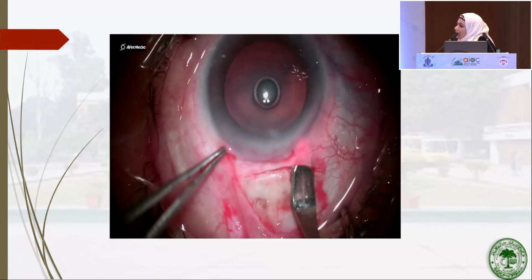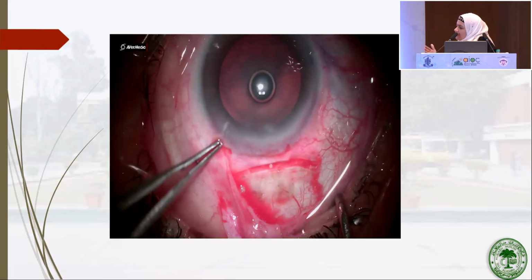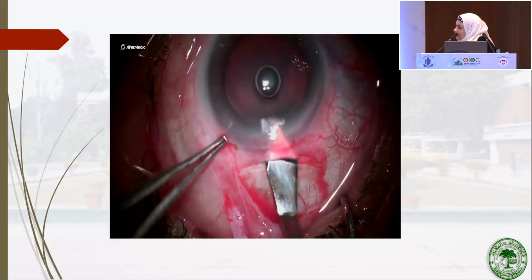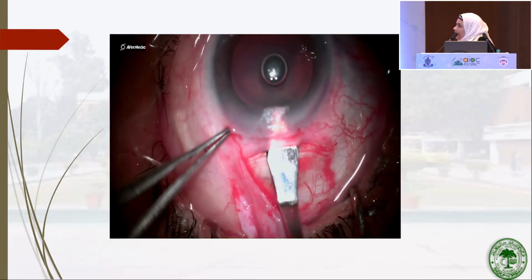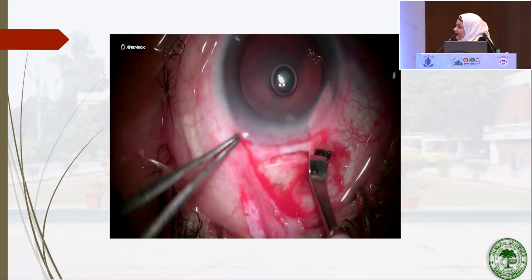For beginners, it is very easy to create a lamellar separation in the three quadrants, and then with care they can join the three lamellar separations. But they may be at different planes at the end, and that may cause more astigmatism. I'm just suspecting, sir, I don't do SICS myself. But for beginners, it is a bit easier.